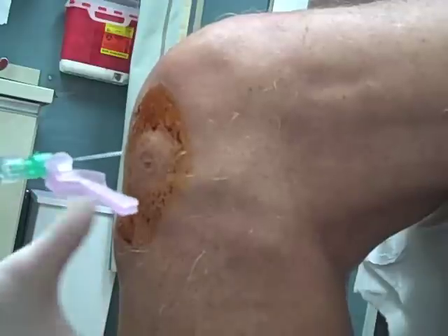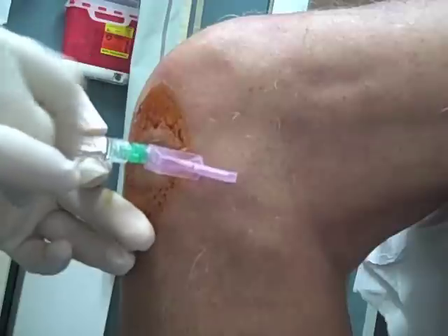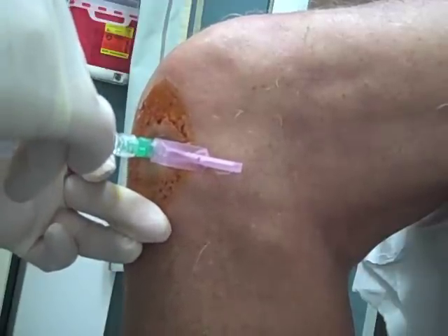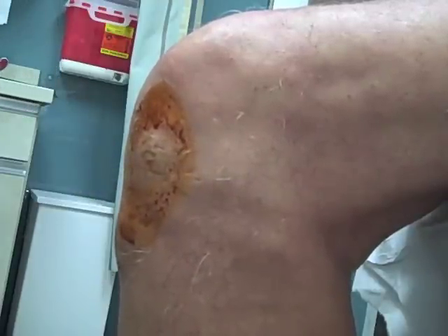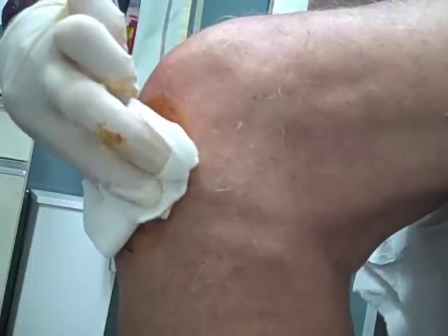With the injection site marked, we keep the needle perpendicular to that and advance the needle and inject the medication. If you encounter resistance with advancement of the needle or injection of the medication, we just reposition slightly until the needle or medication moves smoothly.